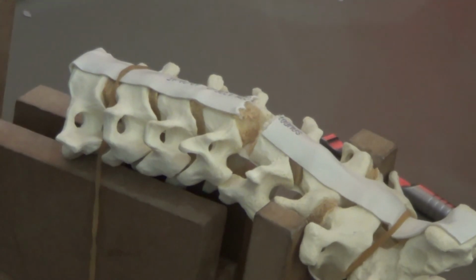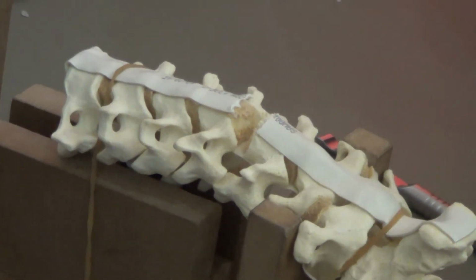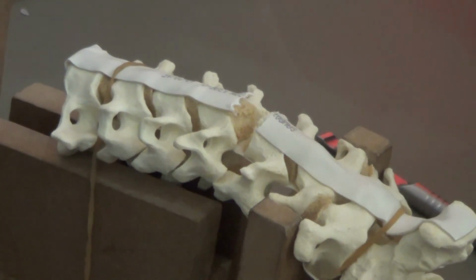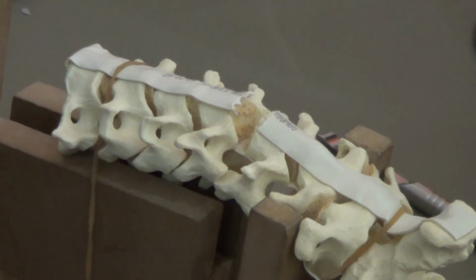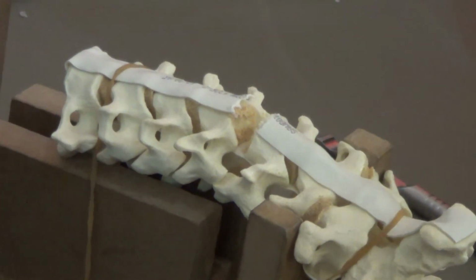Better to cut the posterior longitudinal ligament and see with the loupe and microscope, because a second surgery is not expected or accepted, either by the surgeon or even by the patient. So I don't take any risk. I cut the posterior longitudinal ligament totally, and I want to see, and when I see the dura, then I'm happy.